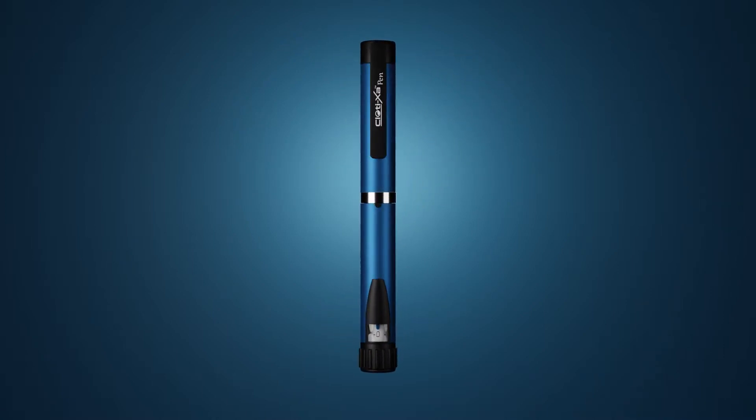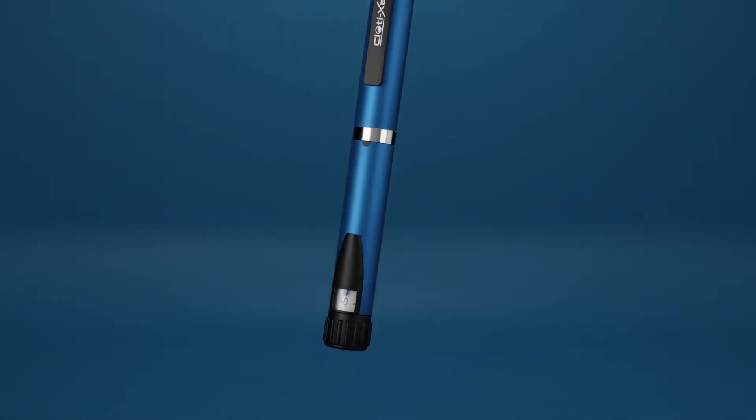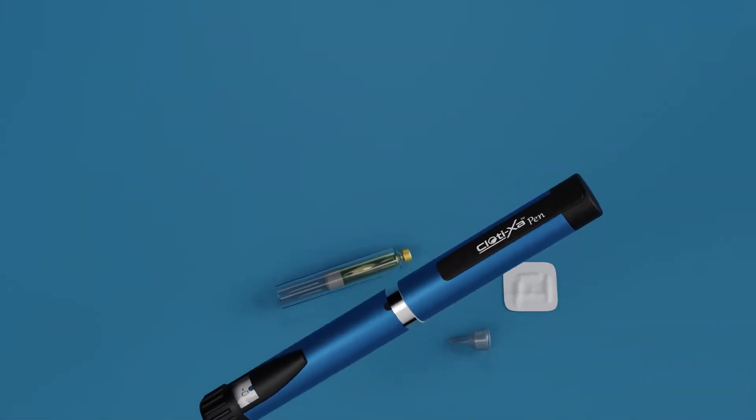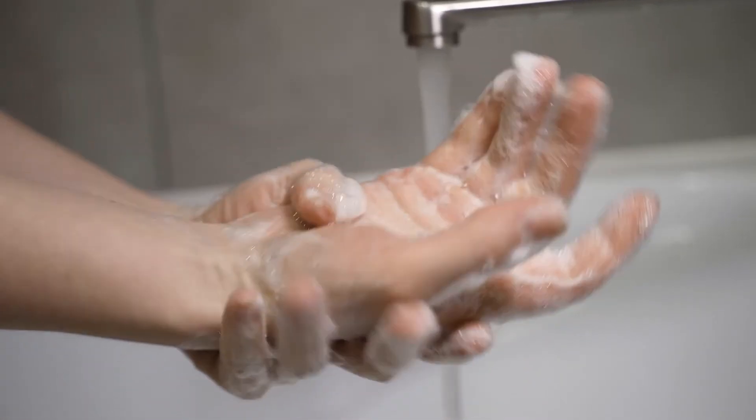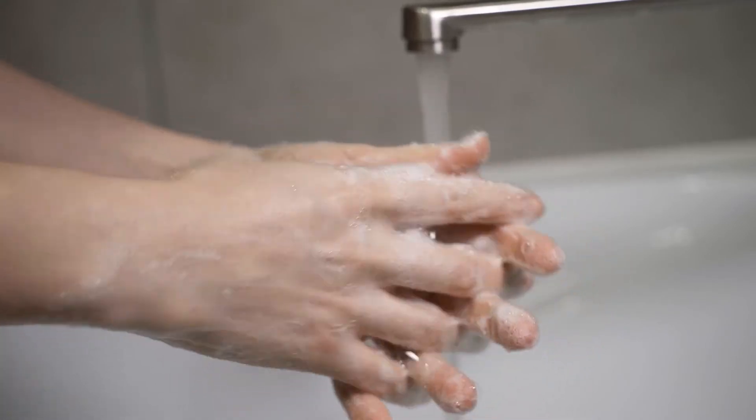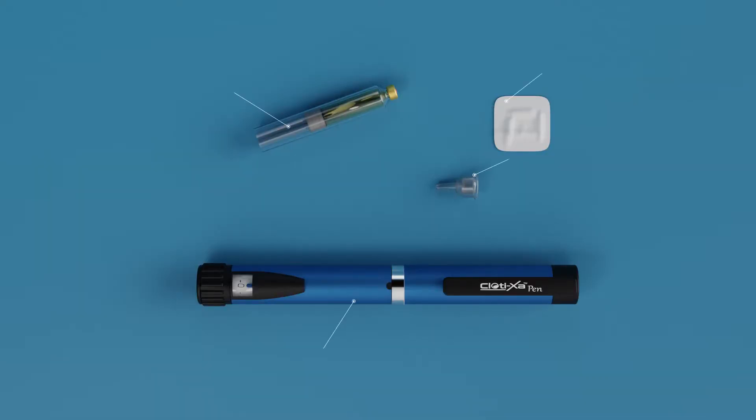Now, let us understand step by step the ways of self-injecting the injection Clotixapen. Before preparing to inject yourself, clean your hands thoroughly with soap or hand sanitizer. Please ensure that you have Clotixapen, Clotixapen cartridge, needle, and an alcohol swab with you.